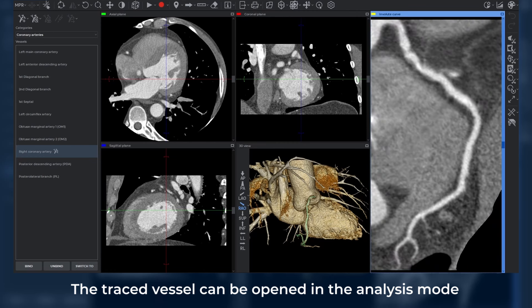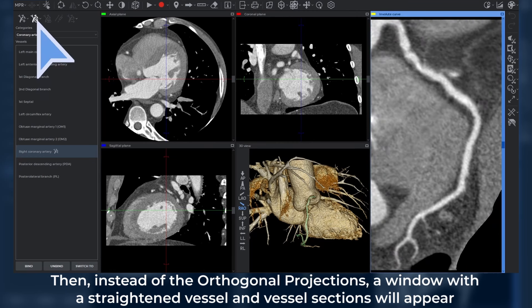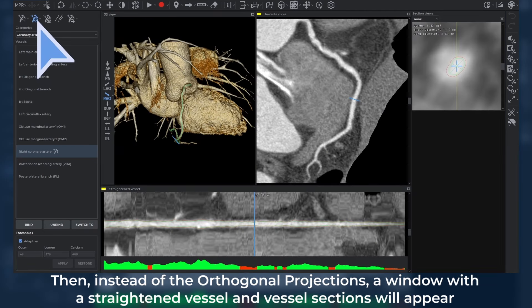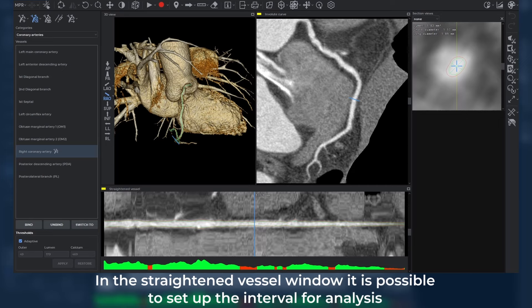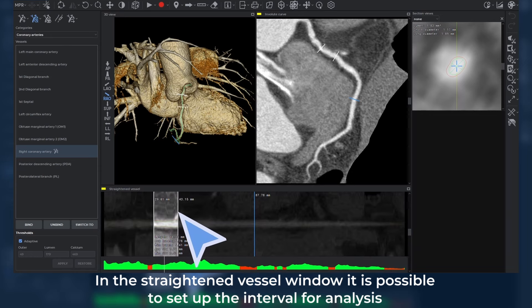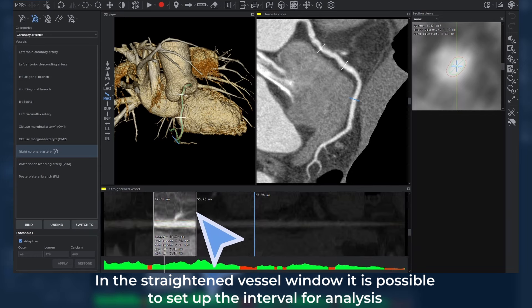The traced vessel can be opened in analysis mode. Then, instead of the orthogonal projections, a window with a straightened vessel and vessel sections will appear. In the straightened vessel window, it is possible to set up the interval for analysis.